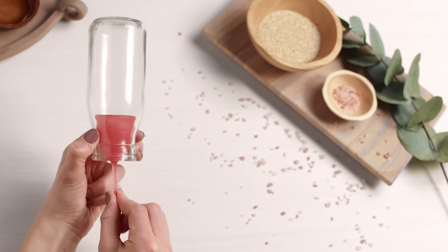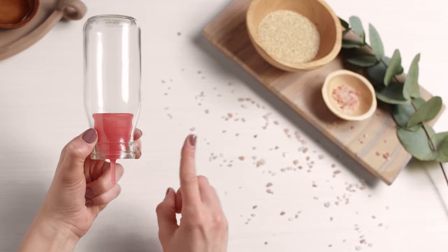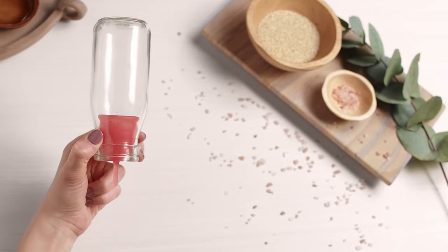Just a reminder: the stem is not a pull tab. Pulling on the stem while the cup is still well suctioned will not feel very great. So always be sure to break the seal before removing your cup.